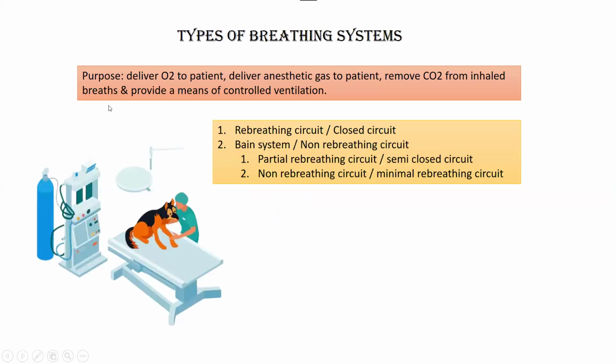First thing is the purpose of this breathing system: to deliver oxygen to the patient, deliver anesthetic gas to the patient, remove carbon dioxide from inhaled breaths, and provide a means of controlled ventilation. So basically, the purpose is to deliver the gases.